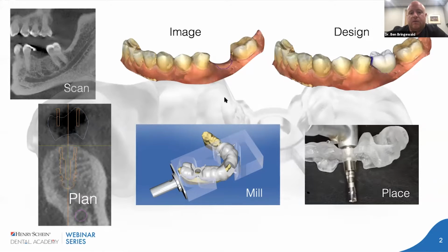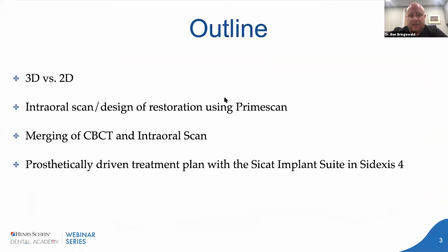So the way that we'll approach tonight is just as a general outline. Initially, we're going to talk a little bit about the advantages of a cone beam CT, not necessarily just for implant related, but also for just generally things that we are prone to missing in just the 2D imaging. Then once we briefly go through that, the main thing of tonight is going to be talking about how we digitally plan out the implant placement with a crown down approach.